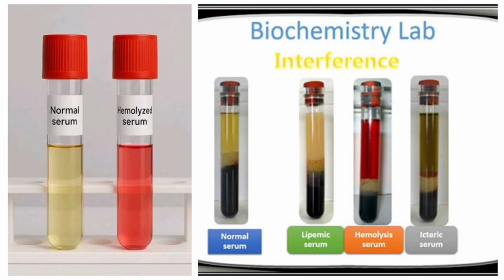Because it is hemolyzed, I might get 550, it may add 50, I might get 600, it may add 100. But that 100 that it added is still within the linearity. That does not make that result correct. In other words, that you get a result that is within linearity does not make the result correct.